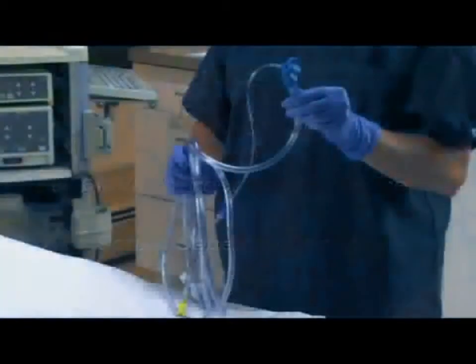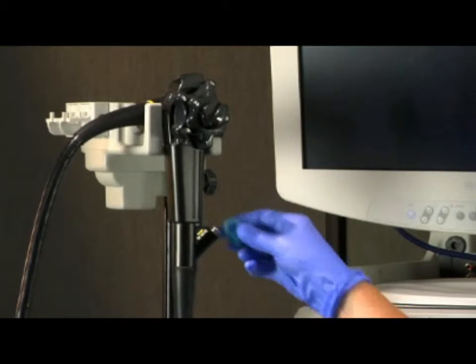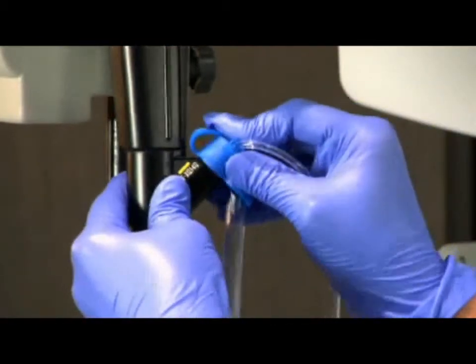To connect the BioVac device using a separate suction canister, remove the existing biopsy valve and attach the BioVac device's biopsy valve to the biopsy inlet.